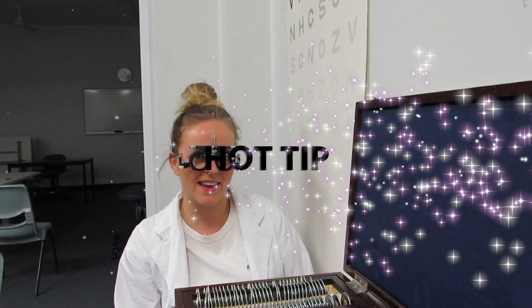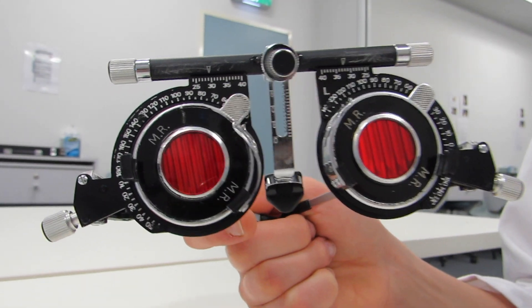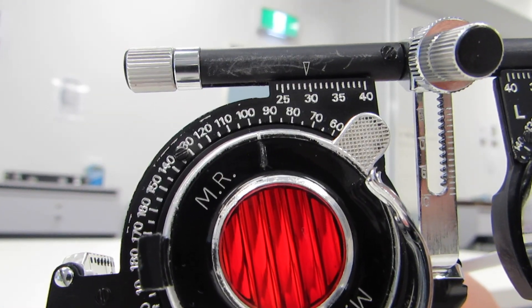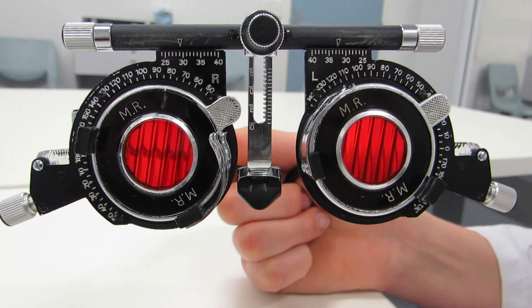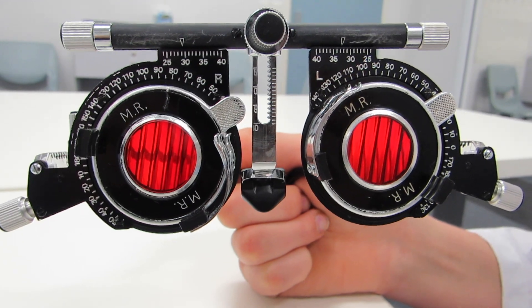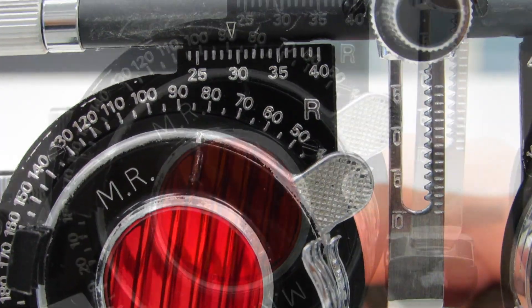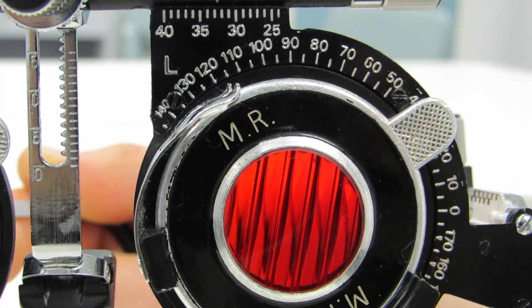Hot tip: When recording, you are measuring the change from 90 degrees. So if the Maddox rod is positioned at 100 degrees, then the patient's eye is 10 degrees excyclorotated. Likewise, if the Maddox rod is positioned at 80 degrees, this would indicate that the eye is 10 degrees incyclorotated. This depends on the trial frames and which eye the measurement is being taken from.